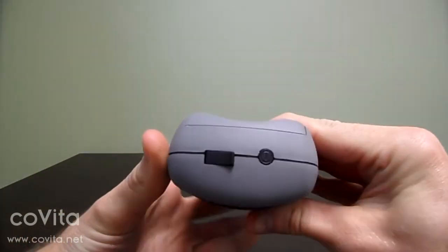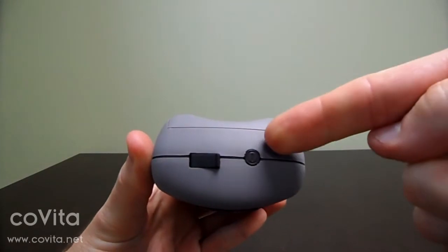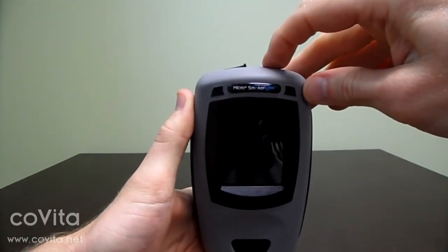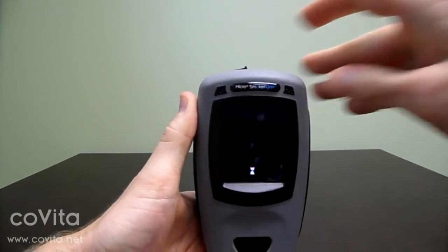Now, turn your monitor on by pressing and holding the power button until the display turns on, then release. Allow your monitor to boot up to the home screen.